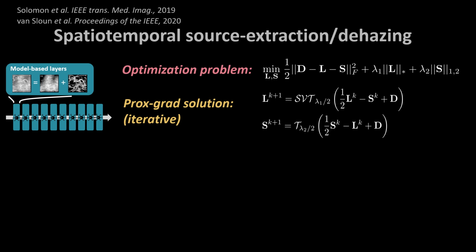A stack of images over time of tissue is going to be low rank, it's spatiotemporally smooth, whereas blood vessels, S, are sparse in space while smooth over time. If you see red blood cells moving, and you look at various frames after each other, then they will be smooth. There's a continuous depiction of the vasculature, but they're sparsely distributed compared to tissue.